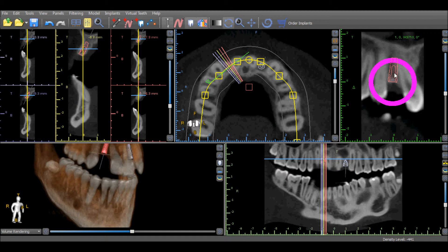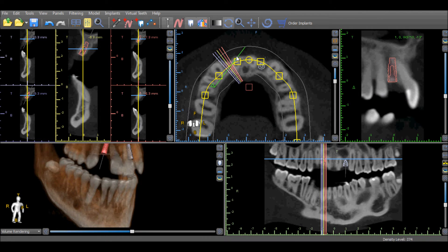It is possible to rotate around the implant by either using the slider to the right of the tangential view, or by grabbing the green indicator in the axial view with your left mouse button and rotating it.